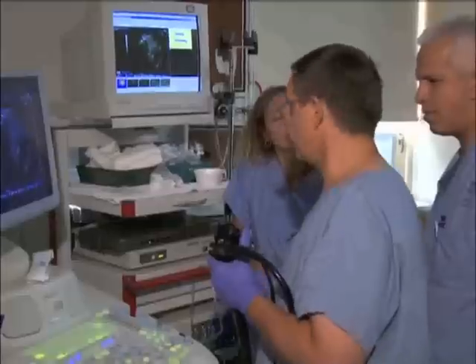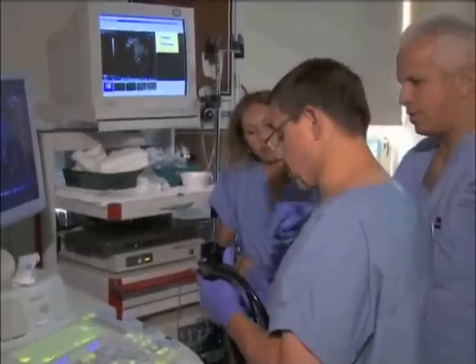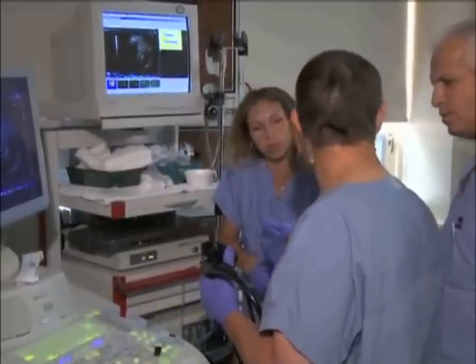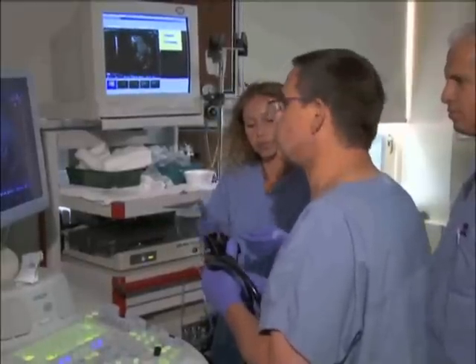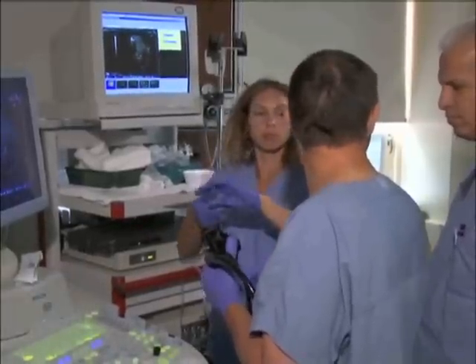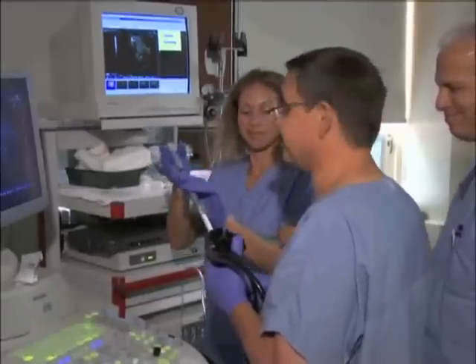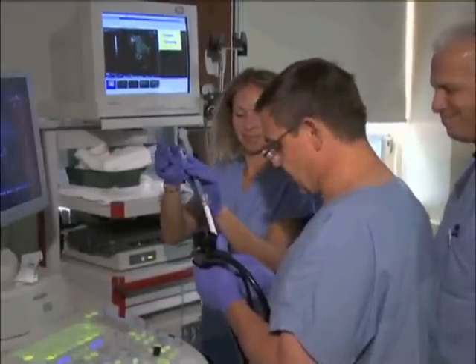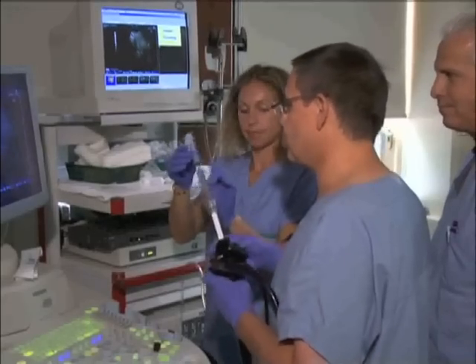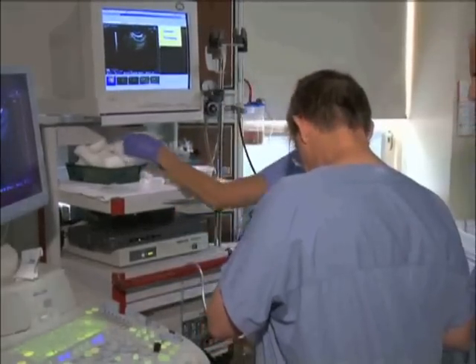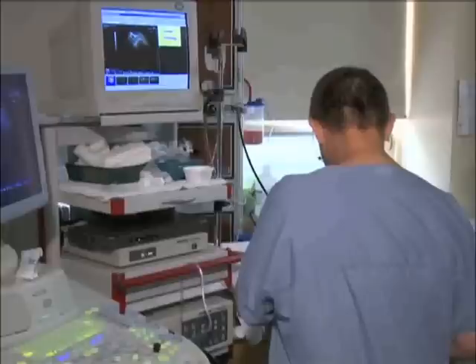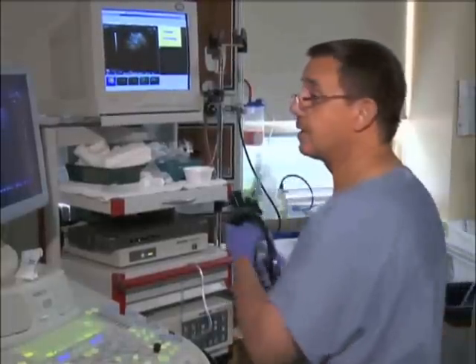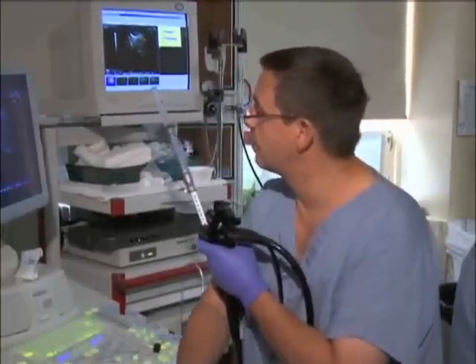Do you block both controls when you are here? No, only with the EUS. I block my wheel — both of them. This is not strictly necessary, just a habit. You see, it's better to put the needle in, because sometimes if the scope is bent, it's better to remove and come back at the level of the lesion. Never push the needle when the scope is bent. I adjust the length of the sheath to have the shorter one here, because we are in the duodenum.